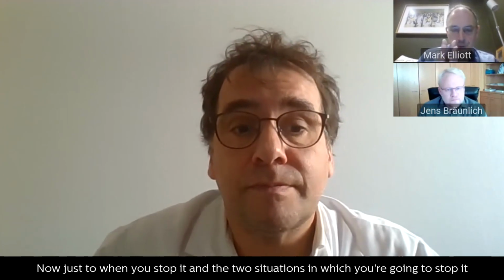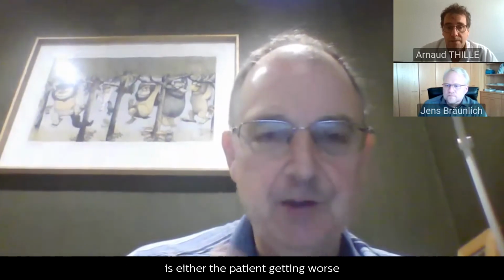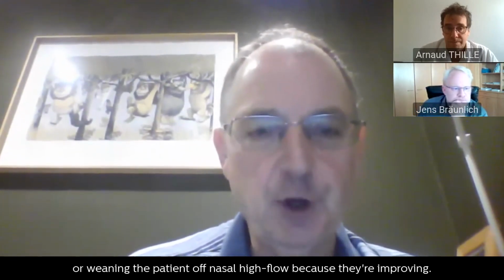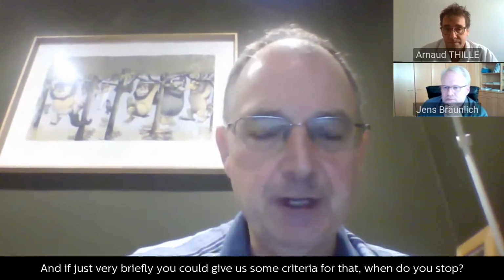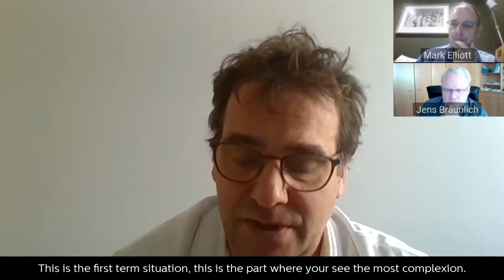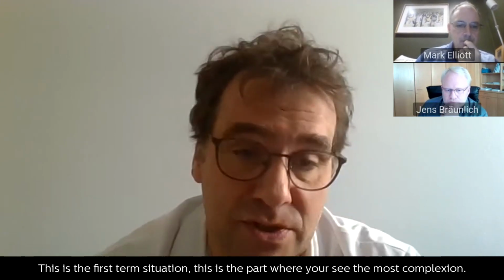So just to clarify when you stop it, and the two situations in which you're going to stop it are either the patient getting worse, or weaning the patient off nasal high flow because they're improving. Very briefly, could you give us some criteria for that? When do you stop? First situation, in case of worsening. This is obviously the most complex one.